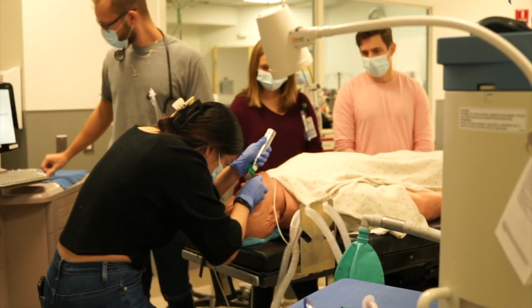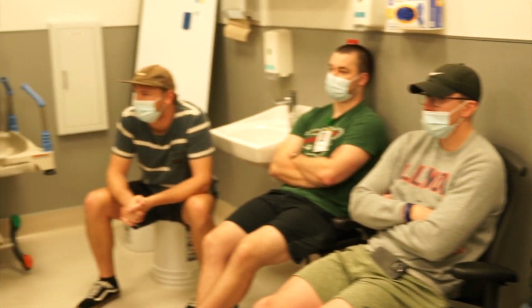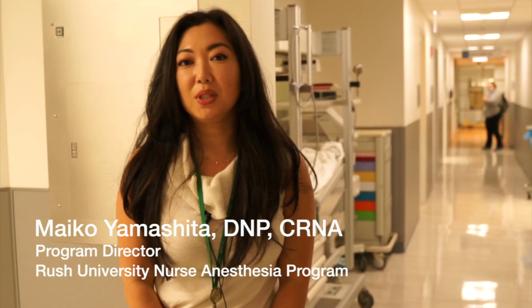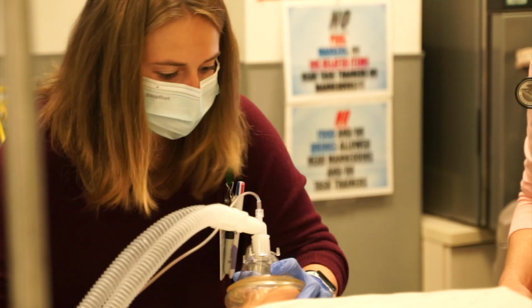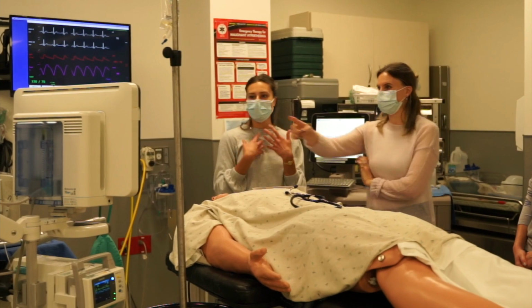The primary focus today was to do an induction sequence and have the perfusion students be incorporated into our anesthetic plan, as well as incorporate some communication between the two. We have a group of students coming to the OR simulator, and they're doing an anesthetic induction for a patient with aortic stenosis and planning out an anesthesia care plan for that patient.